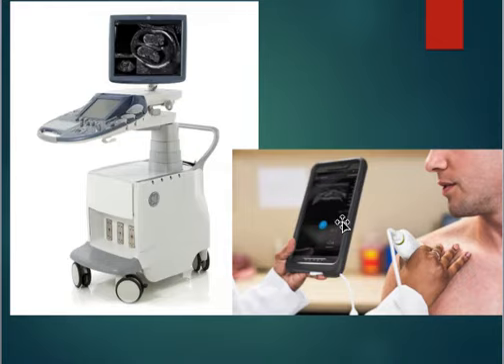This is more of a portable system, so this transducer can hook right into an iPad. Some of them have their own viewing devices. But the handheld is kind of nice because it's portable. It's very portable, right? I mean, doctors can use them and have their own for quick viewing.